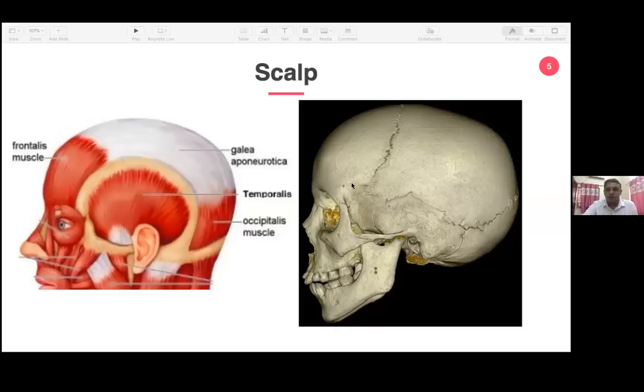We are not interested in this region, but we are interested in one more region called as Asterion. Asterion is the point where the lambdoid suture meets the parieto-temporal suture line here. So why are we interested in this area is this is the area where you make a well or bed for cochlear implantation receiver stimulator. So this is the area of interest to make a bed for cochlear implant receiver stimulator.